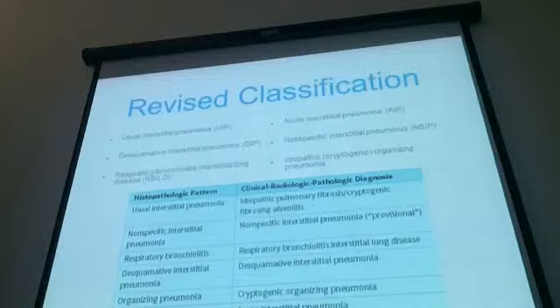And it correlates with the radiologic features of pulmonary fibrosis or cryptogenic fibrosing alveolitis, a fibrosing disease that produces honeycomb change and so forth. And likewise, each of these other disorders has particular clinical patterns that the radiologists will describe. Sometimes it's the same, like DIP here, or cryptogenic organizing pneumonia, and sometimes it's a little bit different terminology. So recognizing that it's very important to correlate what we see with what the radiologist has seen and the clinical course to that point.